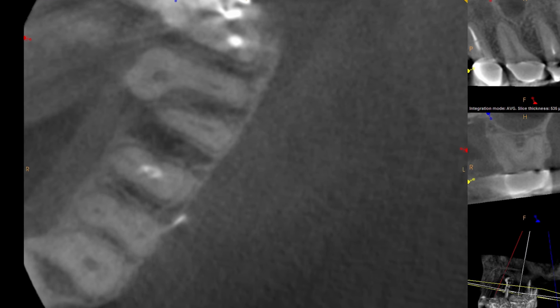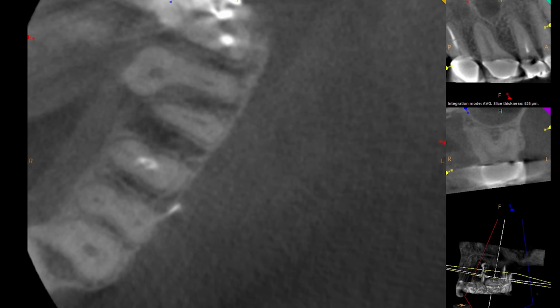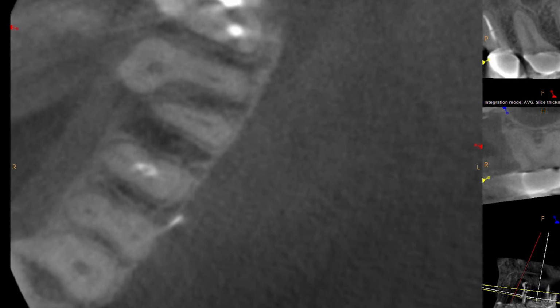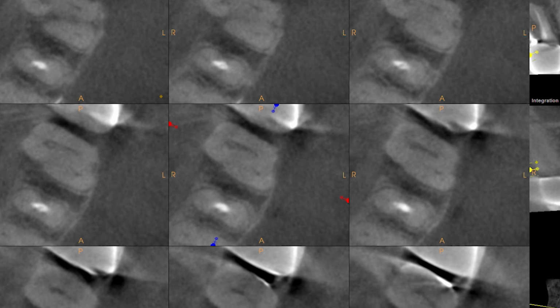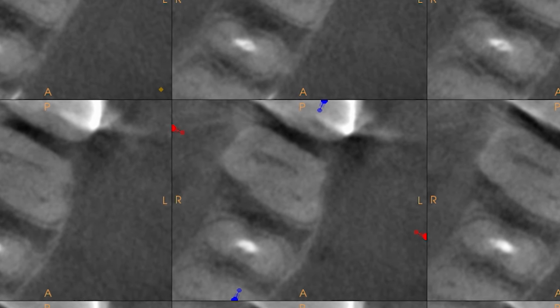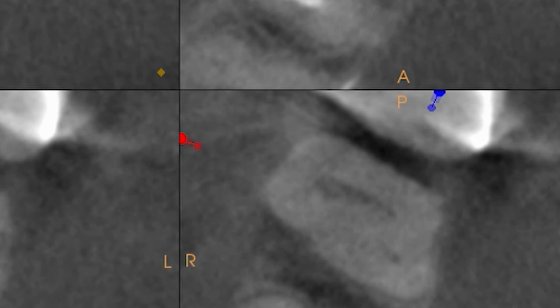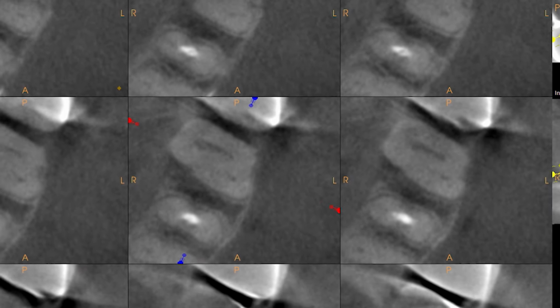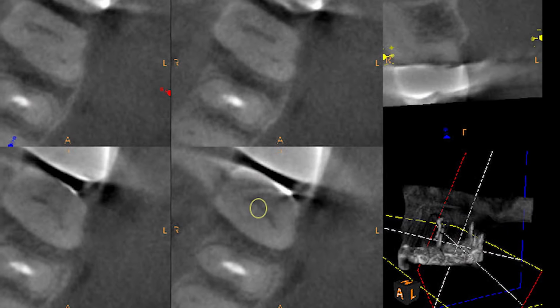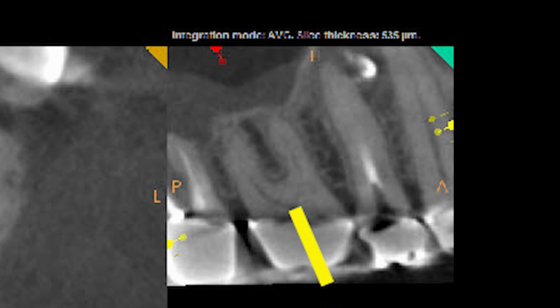Here's another example of a complete case where I have to find a very narrow MB1, MB2 in a tooth with a high furca, so the accuracy of the access is very critical here. And as you look further in the CT, you can see that the access here is going to be critical. So you want a very accurate access. To do that, you have to be able to really see what you're doing while you're drilling. So this is actually how I plan the access. You plan your access before you actually go in.